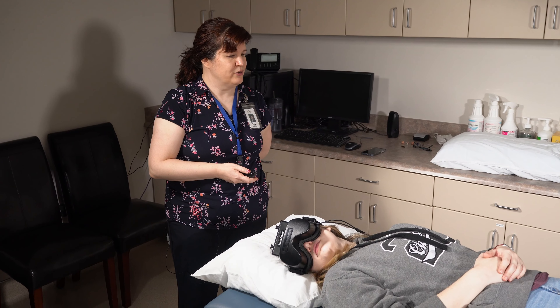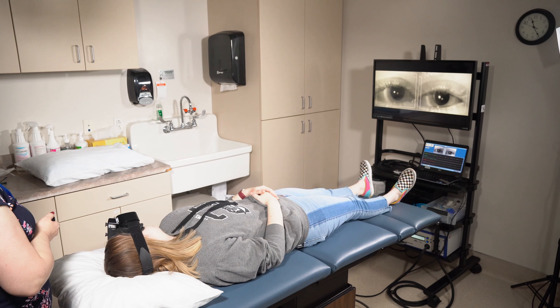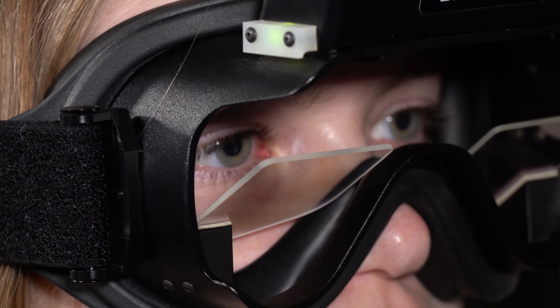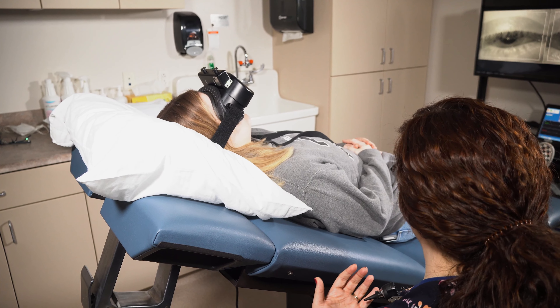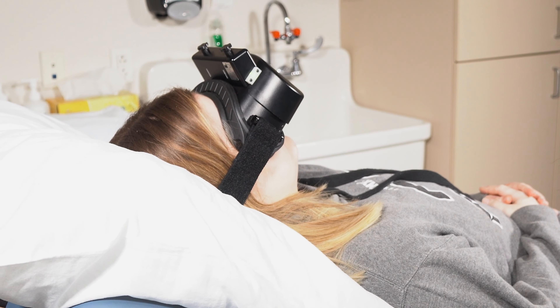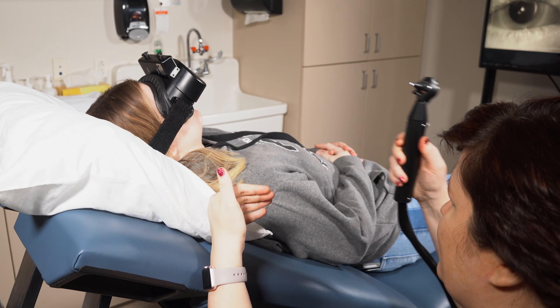Go ahead and move your head to the center so you'd be looking at the ceiling, then go ahead and turn your head to the left. For this part of the test we test the horizontal semicircular canals of the inner ears directly, and the way I do that is with temperature. In the old days we used cool or warm water; now we use cool or warm air because it's less messy and it does the same thing.